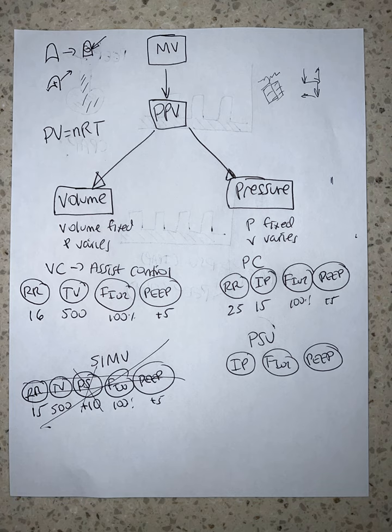Now, I like it because if something happens and apnea ventilation gets turned on while they're on pressure support, something is going on. I'm either overventilating them, or God forbid something happened in their brain and they no longer have a spontaneous respiratory effort. Pressure support ventilation is more comfortable for the patient. I've actually put students and residents, and when I was a fellow, fellows, on it, not intubated them, but had them feel it, and pressure support ventilation is much more comfortable. It's flow triggered, a different triggering mechanism. It's much more comfortable.